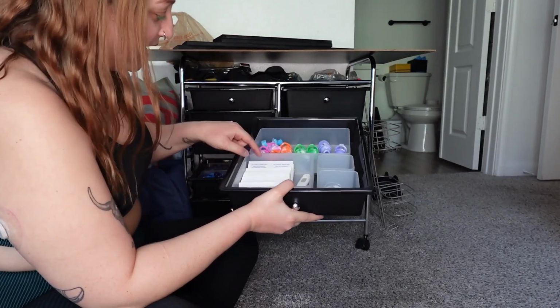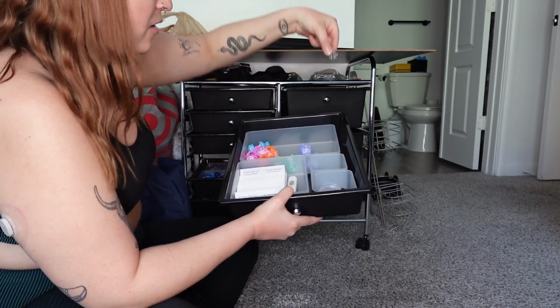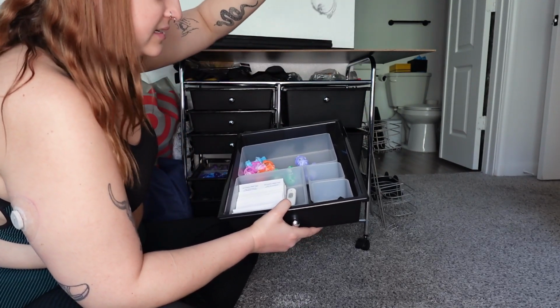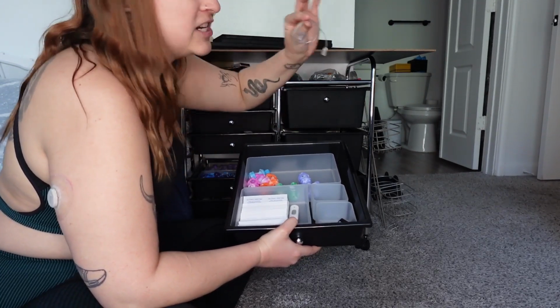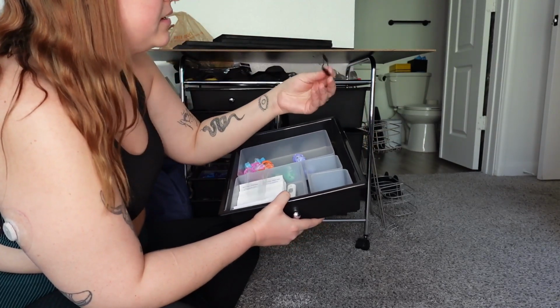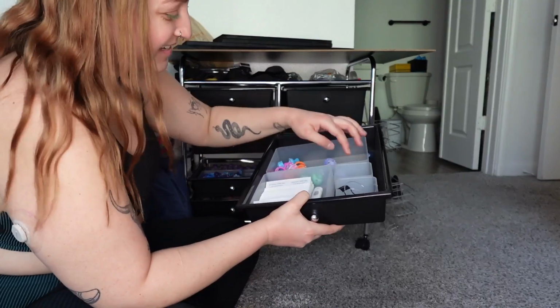Anyway, next we have alcohol pads, a thermometer, the little clips that go on when you're swimming or showering or bathing or whatever. Any extra tubing, you know, when you lose a pump site, what a warrior, and you have to change just the site, I keep the tubing sometimes just in case. This is the clip for the iLet. I've never used it. I just shove it in my leggings if I don't have pockets.